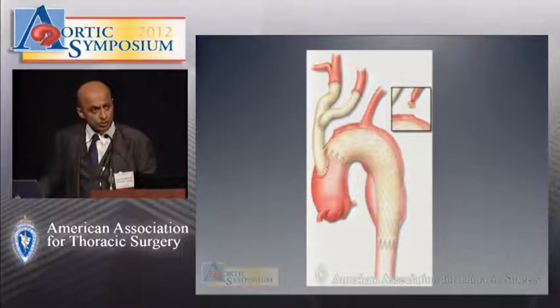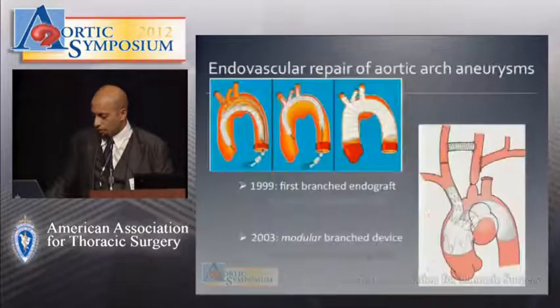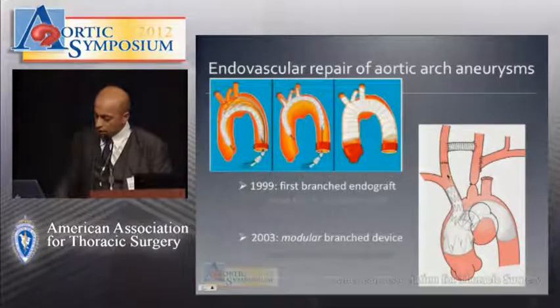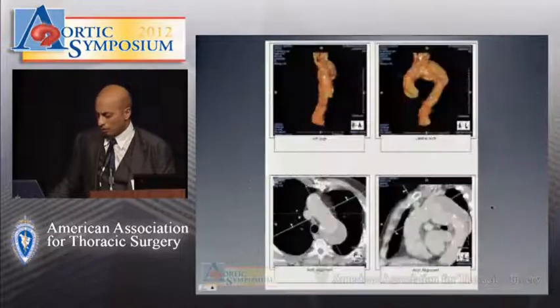Up until the last year or two, this was sort of the minimally invasive way of treating these kinds of aneurysms, and I would hardly say that these are minimally invasive. These were usually reserved for high-risk patients, and a lot of them didn't do very well. The techniques that I'm going to be speaking about are fairly new, but this whole concept has been around for quite some time. In 1999, Inoue was talking about these kinds of grafts. Back in 2003, Chuter pioneered a technique where we put these grafts through a conduit on the innominate artery or the carotid artery, put in a bifurcated graft from the neck, and then came from below and catheterized the contralateral limb or the aortic limb and extended it with another stent graft. The problem with this procedure is it also required extra-anatomic bypasses with carotid-carotid and carotid-subclavian bypasses, and it was associated with a fairly significant risk of stroke.